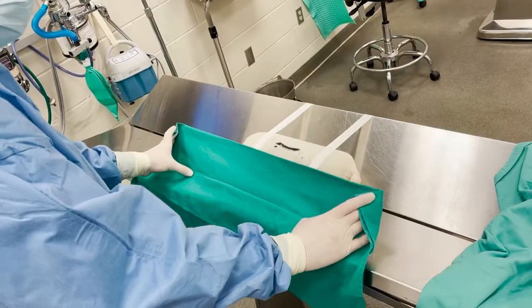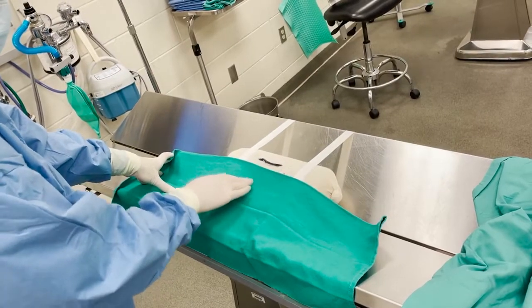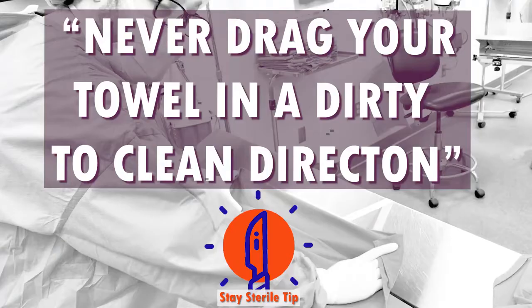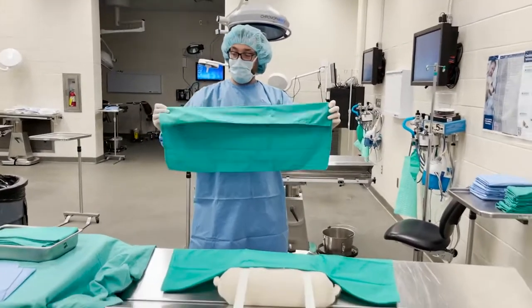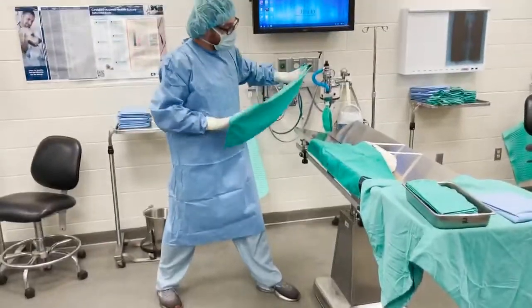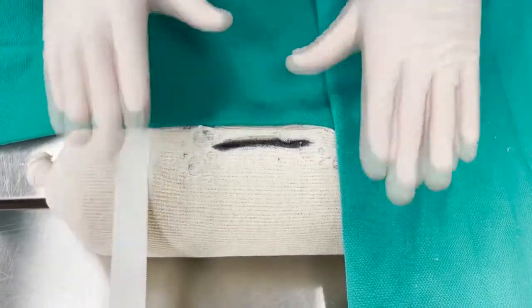If you do have to fix it, it's okay to move your towel away because you're dragging the cleanest edge away. But what you don't want to do is move a dirty edge closer to your surgical site — you should never move your towel towards your incision site after you've placed it. For the caudal towel, same technique. When draping the abdomen, the cephalad drape should be all the way up to your xiphoid and the caudal should be at the pubis, but when practicing, just covering the tape is good enough.